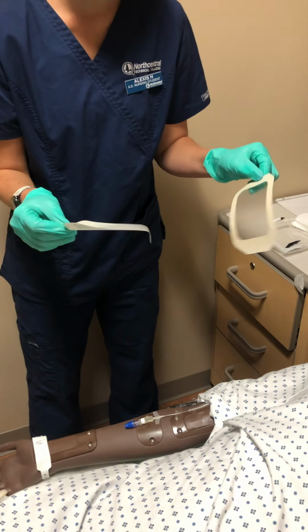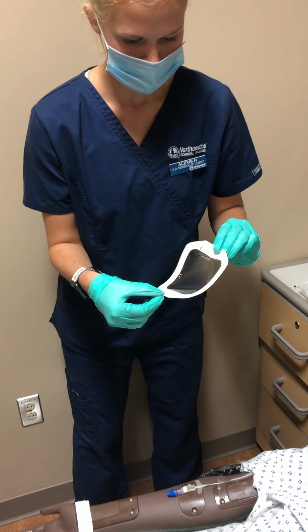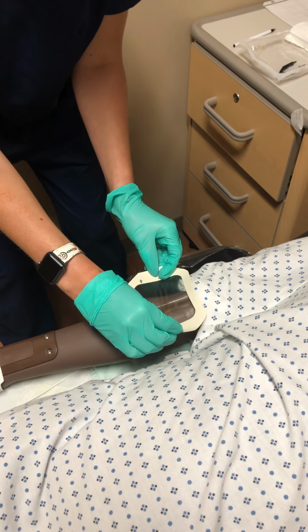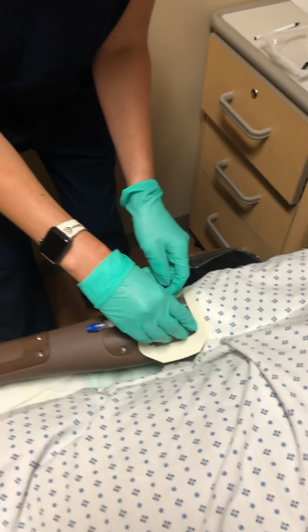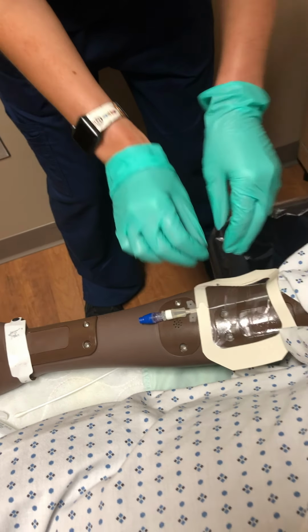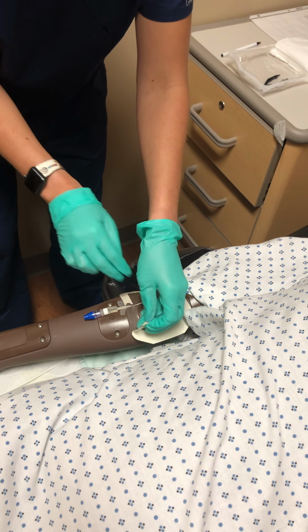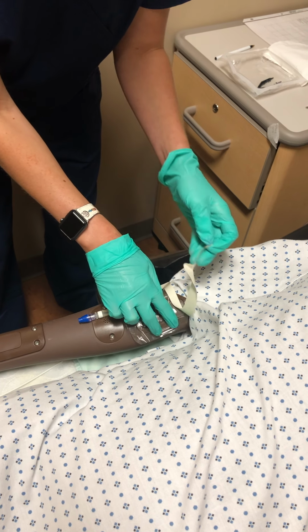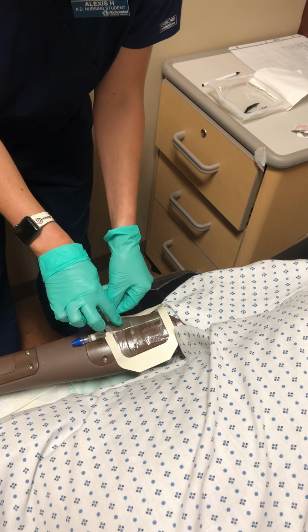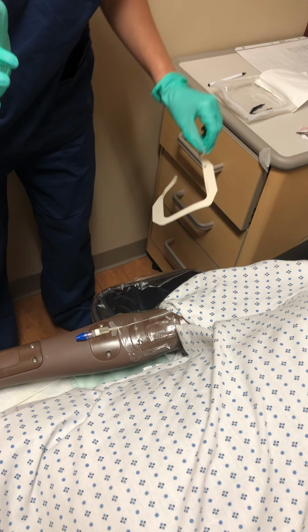So now I'm going to discard that, and then I want to put this smack dab over the IV insertion site. And then I'm going to discard that.